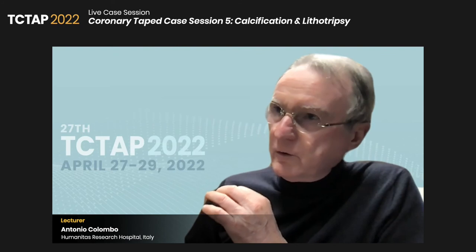As Dr. Ziad and Jeremy pointed out, when the calcium is nodular, it's very difficult to get a good result with a pressure balloon. We have the OPN balloon, which goes to 40 atmospheres, but if the calcium is nodular, you just squeeze the other side of the vessel, which is no good, and you may even create a rupture. So I think cutting balloon, when it's nodular, is okay, but it's not the best. It's a poor man's shockwave, I call it. If you cannot afford shockwave, you can try cutting balloon.